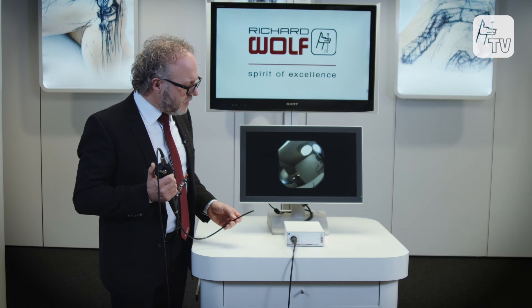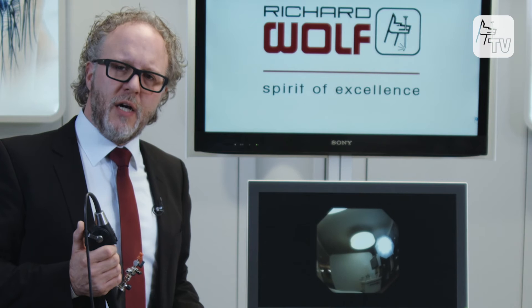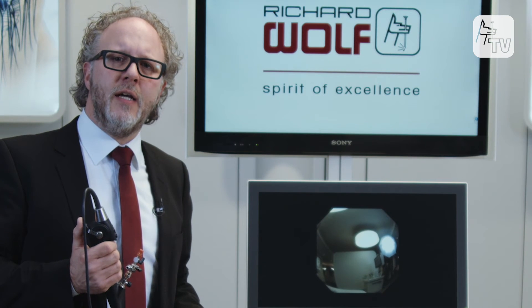This innovative flexible cystoscope combines with the new Richard Wolf EndoCam Flex controller to allow the user to carry out cost-optimized flexible cystoscopy in medical practices and in hospitals without having to undertake time-consuming adjustments beforehand.